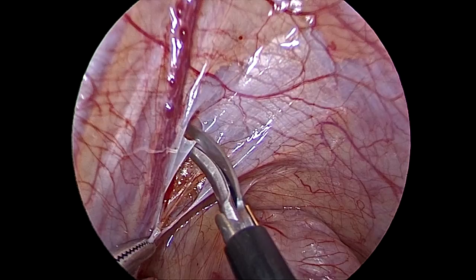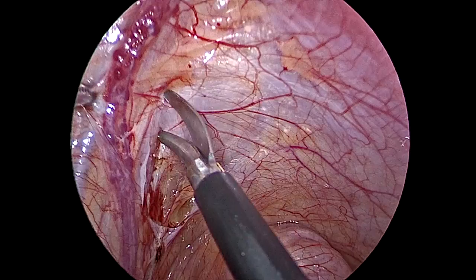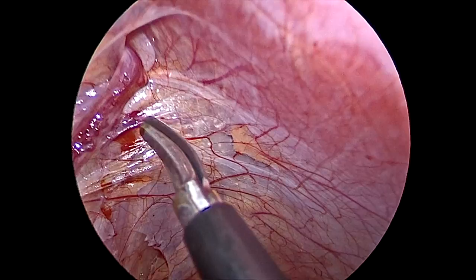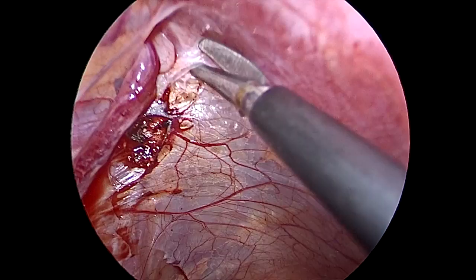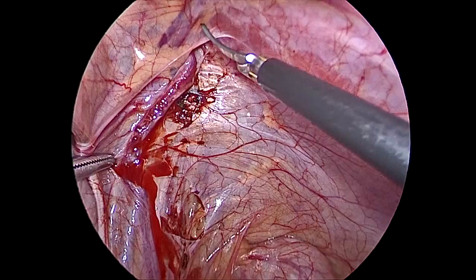Stretch the tissue because it is very elastic and good scissor technique is essential. Vertically up to the inguinal ring, we will cut as much as possible without using cautery. Excessive oozing will also change the field of the inguinal ring. Laterally at the inguinal ring, no important structures come. This is the lateral part of the inguinal ring, and this is the superior part — completely divided here.